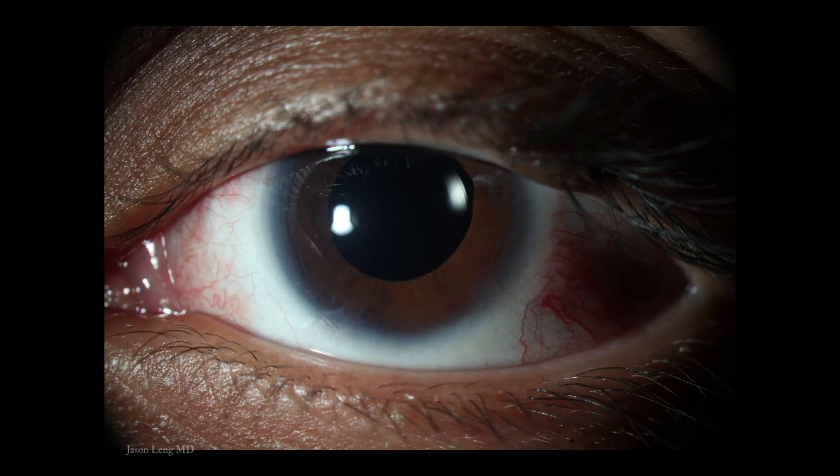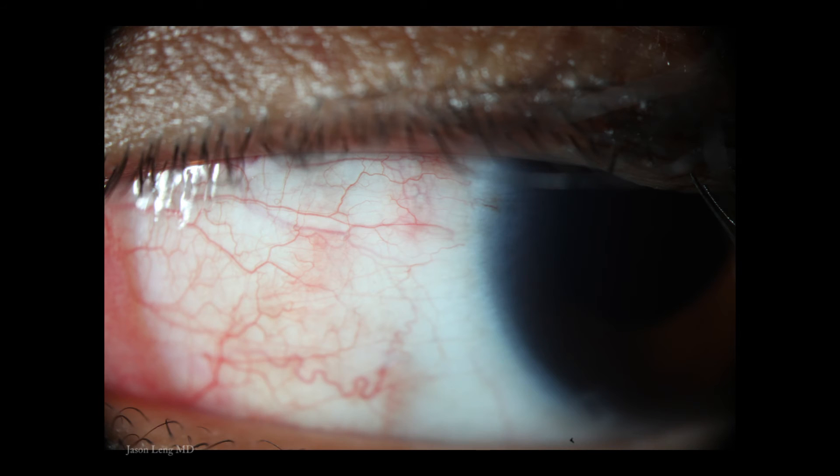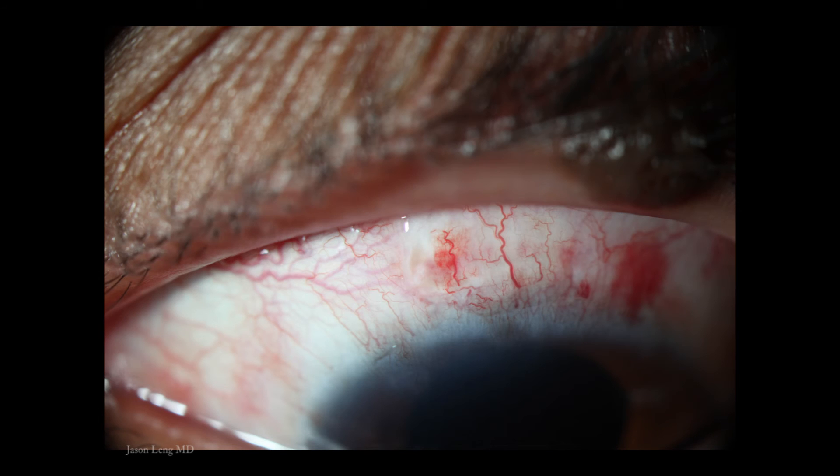Here are photos from the patient's post-op day one visit. As you can see it's very atraumatic with a clear cornea, a little subconjunctival hemorrhage at one of the needle sites, and faint blue where the tip of the haptic is just slightly under the sclera. The superior scleral tunnel incision also looks very good.